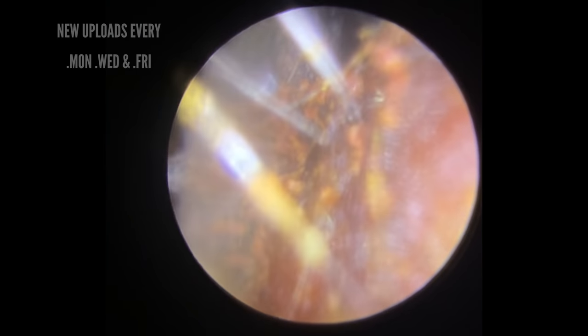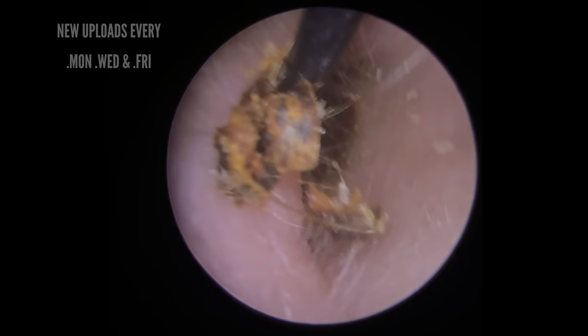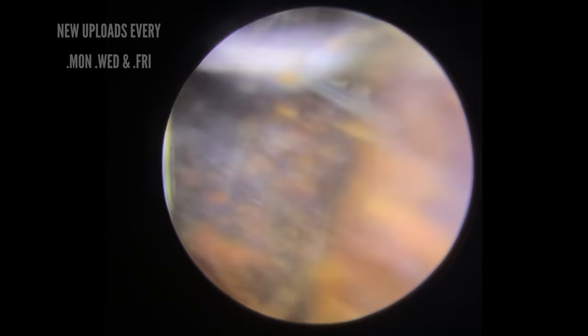You can see really dense cilia here, and with this wax right at the front end at the entrance to the canal, we're having to work behind those cilia to very gently take this away — but it does obscure the view a little bit. As you go a bit deeper in, we'll just push past those cilia.